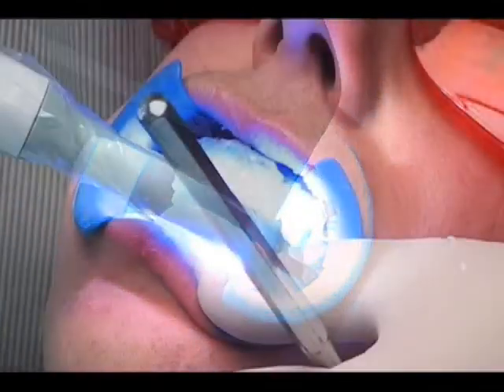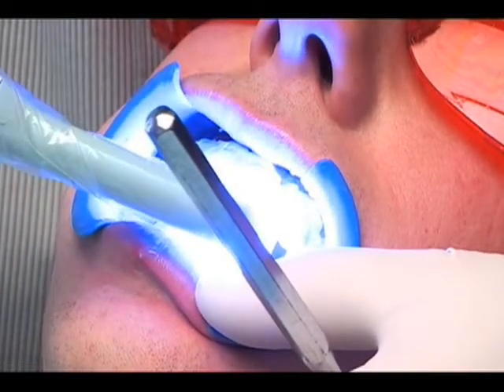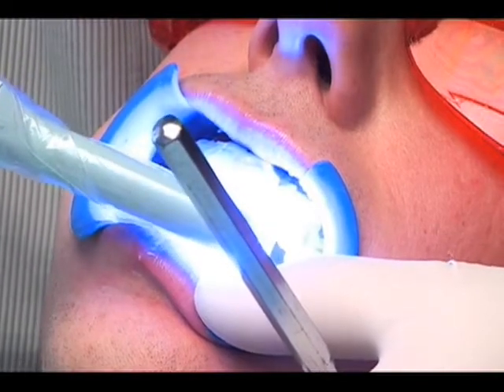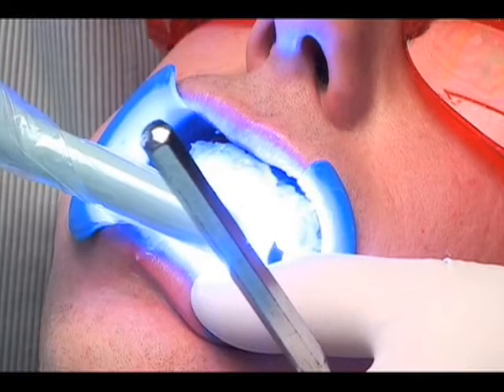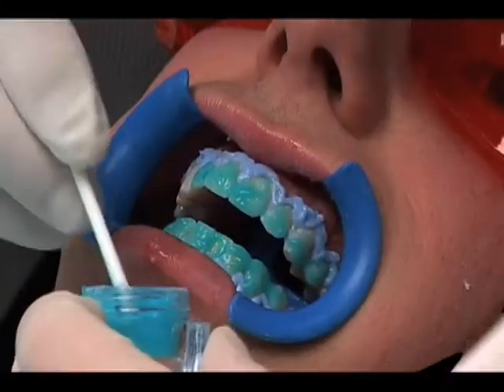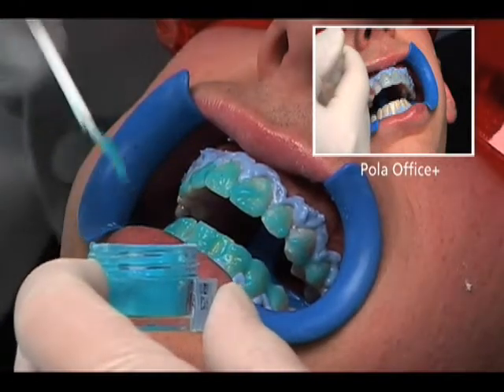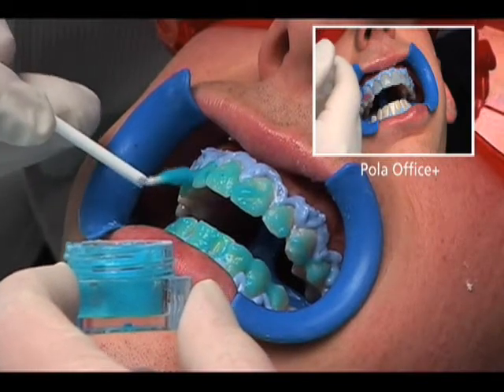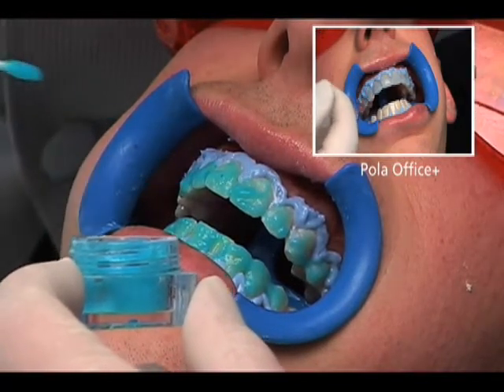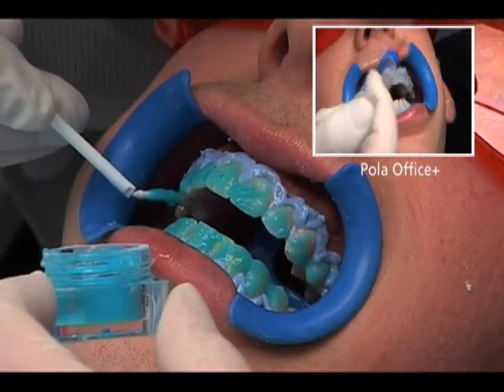Alternative bleaching lights may also be used. Please note, the end result will be the same with or without the use of a bleaching light; however, the treatment time may be shortened when using one. After this time, suction off the gel with a high-speed evacuator. Do not rinse the gel from the teeth. If the desired tooth shade is not achieved after one application, Polar Office may be applied up to four times in one session. You may use the same pot for the first and second applications. A second pot of freshly mixed gel is required to complete the third and fourth applications.